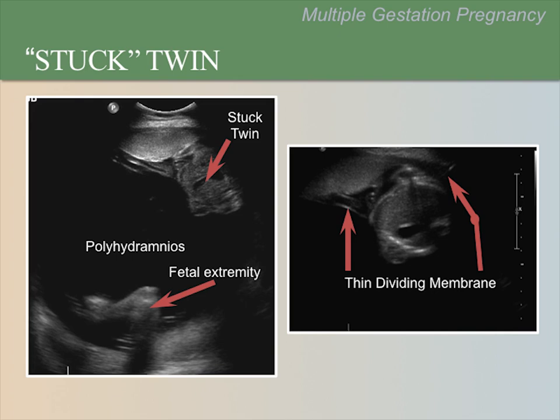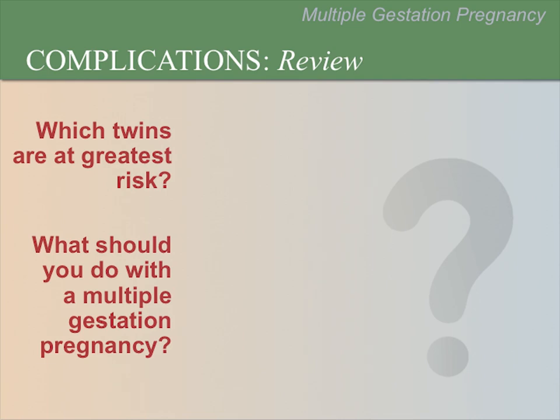the right image. Now let's review key points. Which twins are at greatest risk of complications?